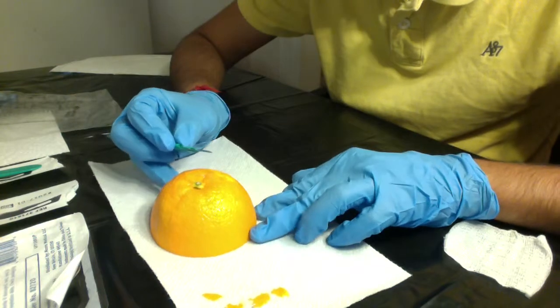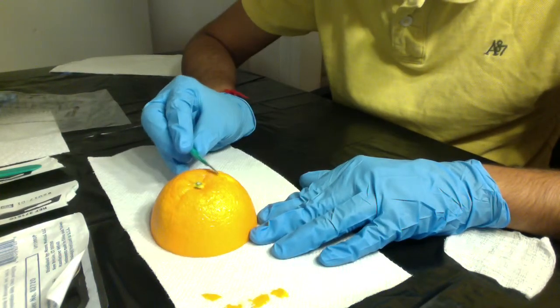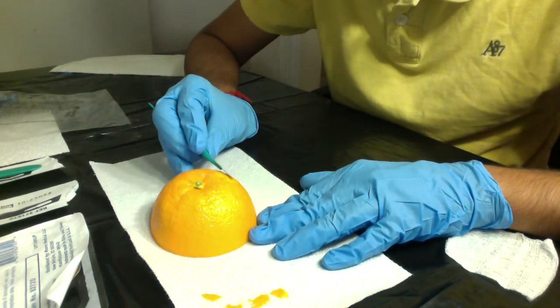Trying to make sure that I don't cut very deep, so as not to cut the viable tissues, and going very superficial.